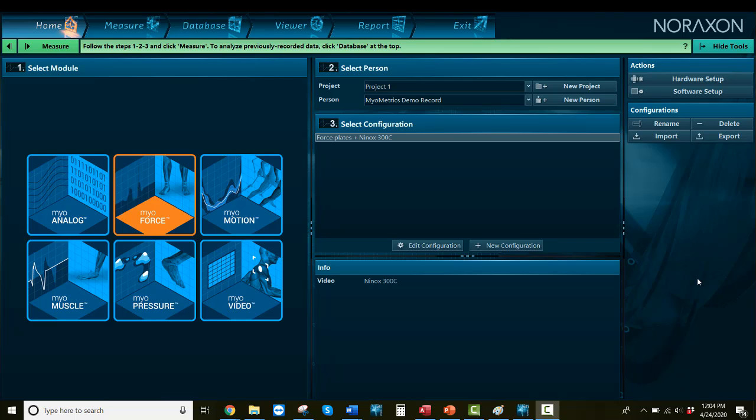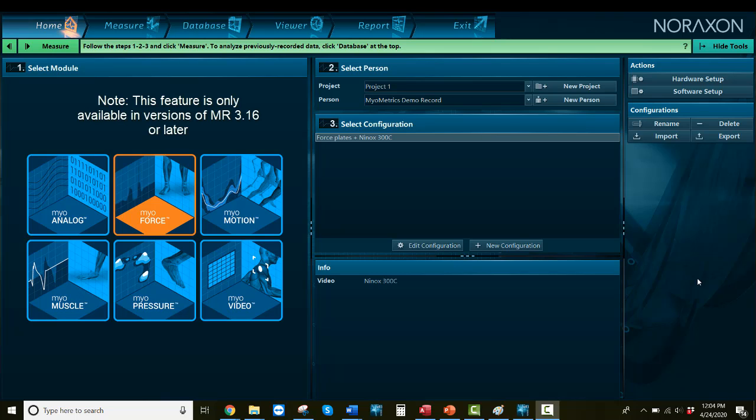Hello, welcome to Noraxon's Myoforce Center of Pressure Trace Setup Tutorial. COP tracing is a feature available to supported force plate types through MR3 and is only available starting with the MR 3.16 release.